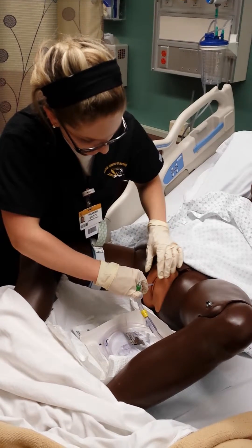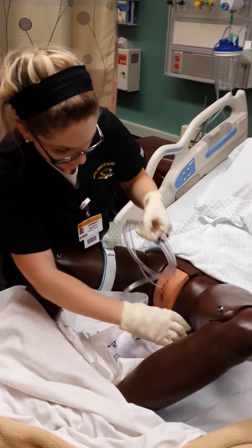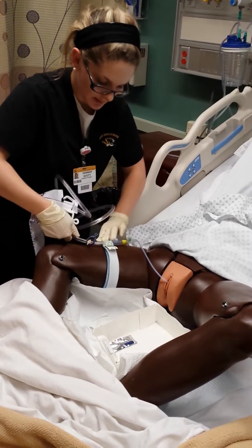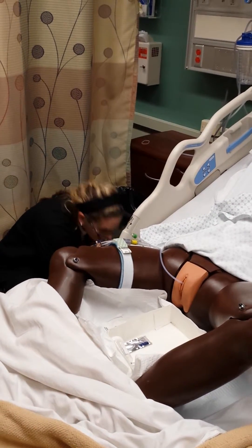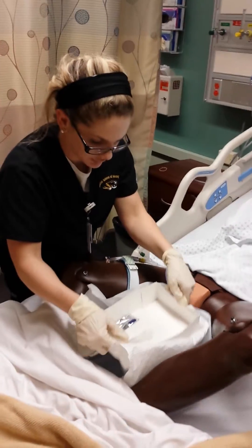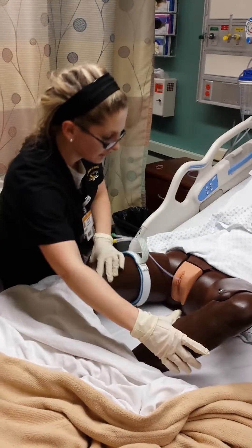And it's secure. So now we're going to go ahead and attach the catheter to the leg piece. I hope that wasn't too painful. If you do have any pain, I'll be back in a while to reassess, and good luck on your surgery.